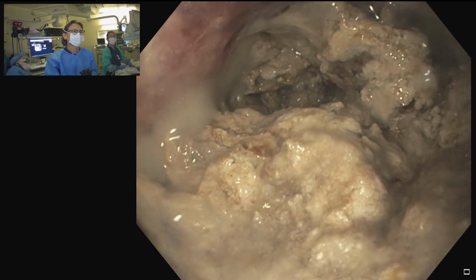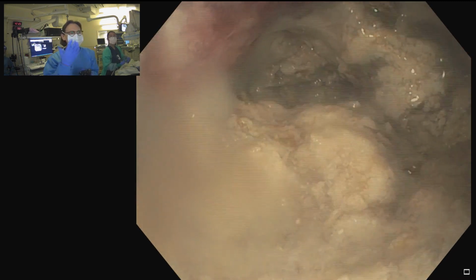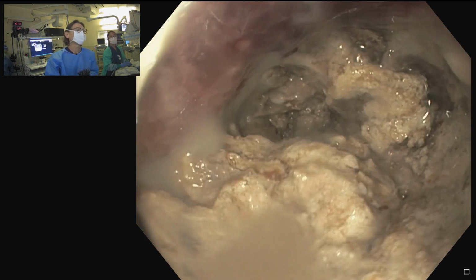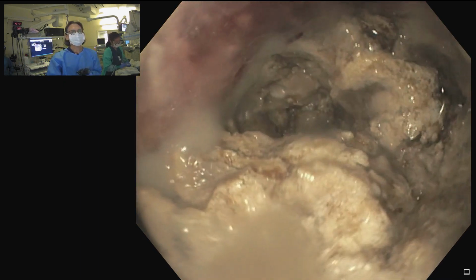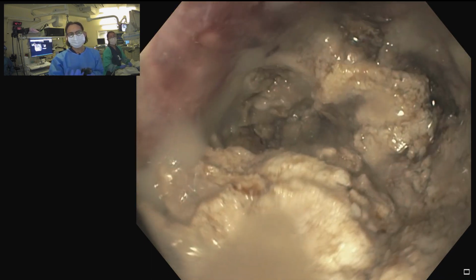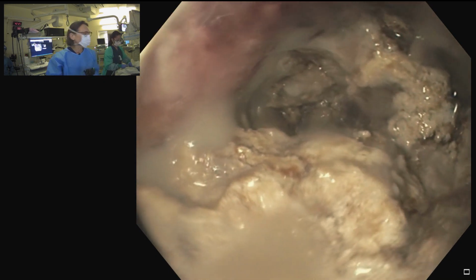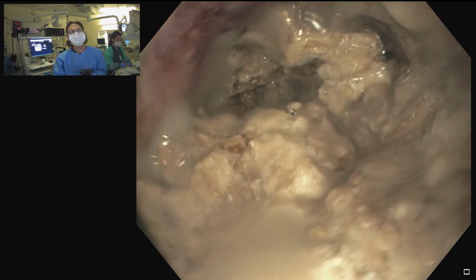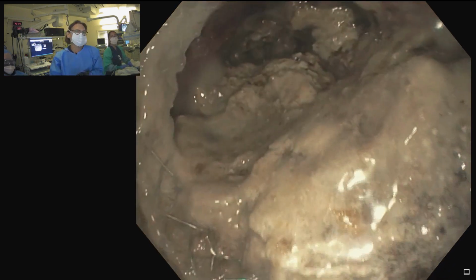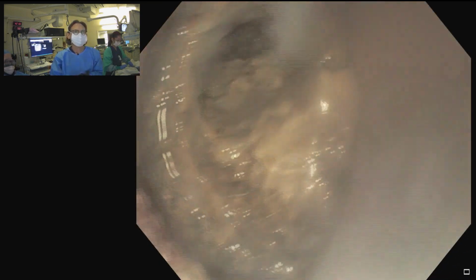Can you just follow the trail of saline as well, or no? You could, of course, but the blue would be very obvious if you saw it trickling. So keep going. You've got to inject a lot. Yeah. So actually, if we had two pumps here, I would have this hooked up to a pump and really irrigate it well. The patient's going to go to the radiologist, so we don't see anything. So let's stop here. They'll define the entire anatomy. And then like I said, I think I'm probably going to be doing debridement here with the EndoRotor, the PED device.